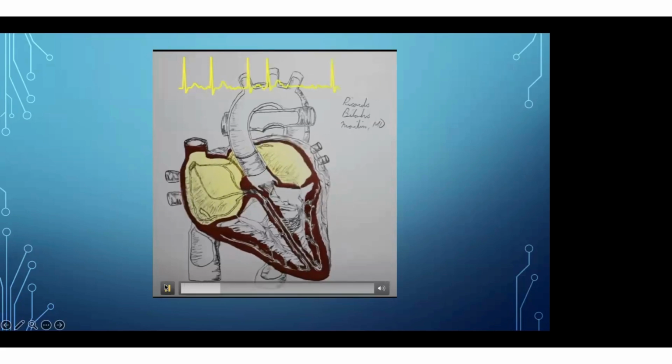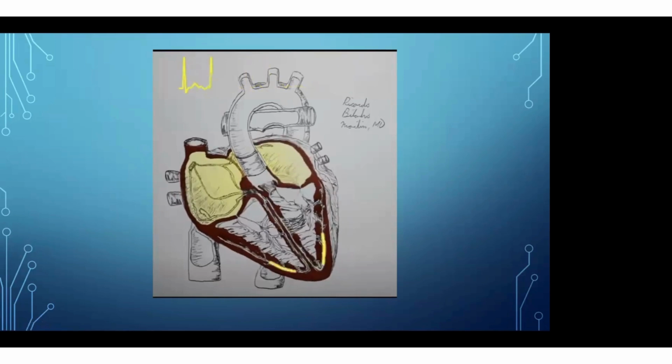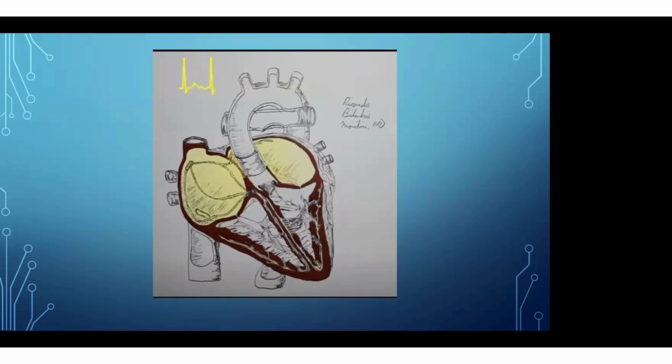Multiple things are there for atrial fibrillation. So atrial fibrillation is so common, it will usually have an underlying cause, so you have to find it out. With atrial fibrillation, you have to stratify for stroke also.